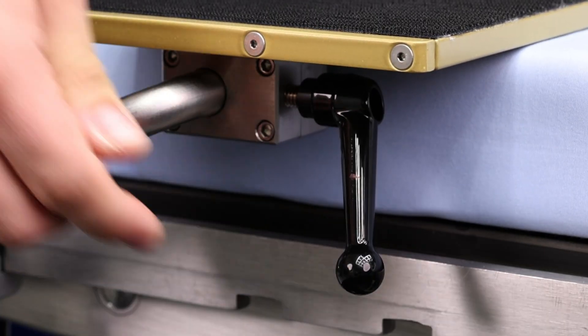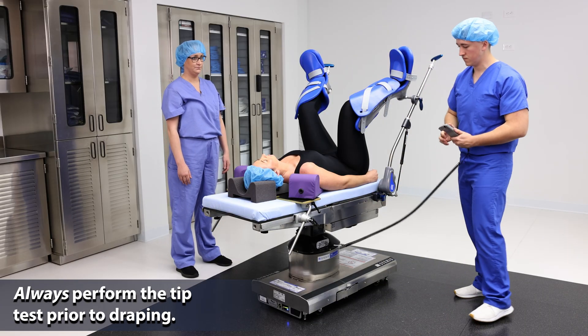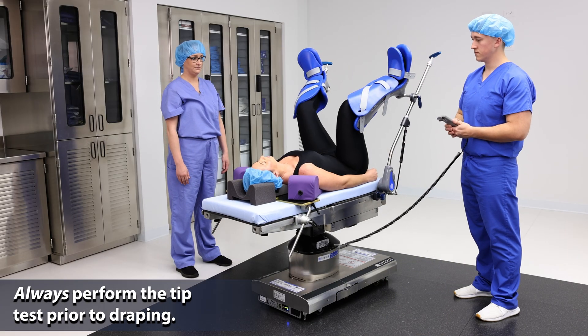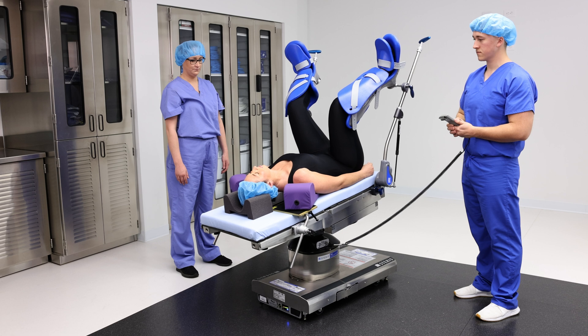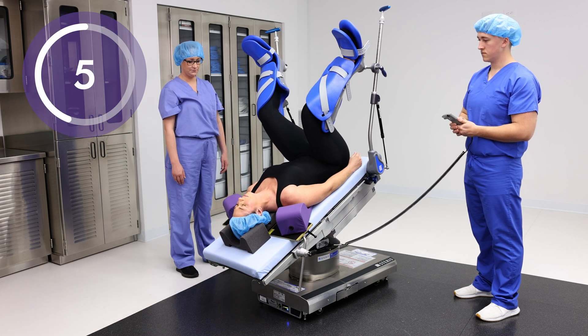Double check the clamps and the locking levers. Always perform the tip test prior to draping by bringing the table to the full operative degree of Trendelenburg.